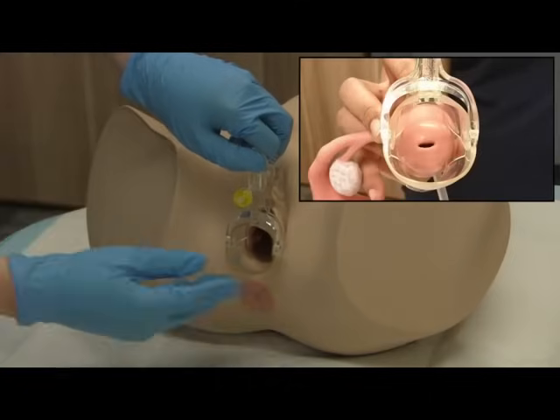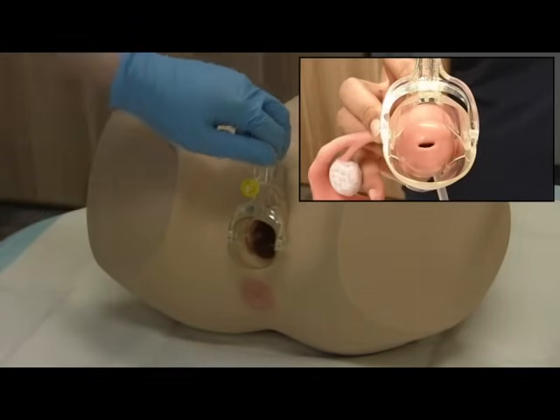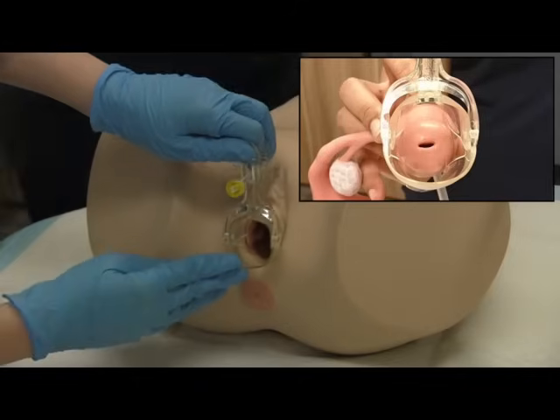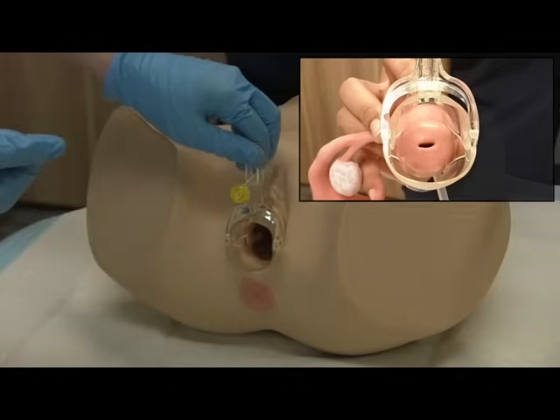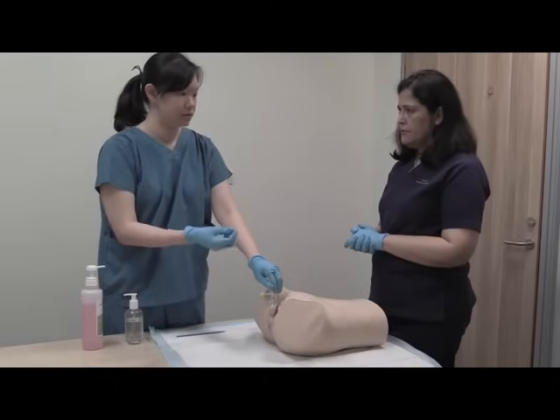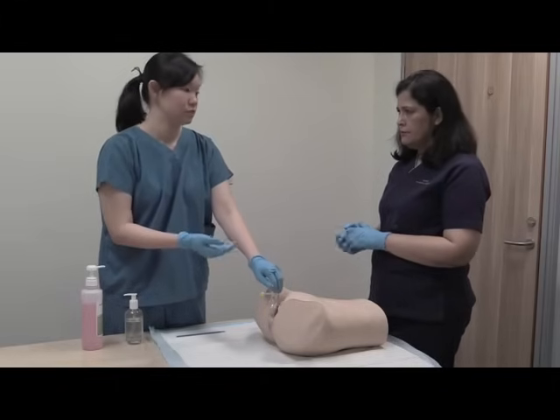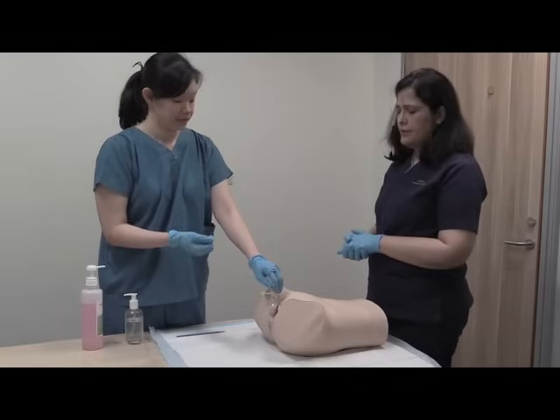Now I'm able to see the cervix in whole as well as the visualized cervical fornix, and it looks normal — there are no obvious cervical lesions or masses, no bleeding or discharge. I will also look at the vaginal vault to see whether there are any vaginal lesions, any bleeding, discharge, or other problems.